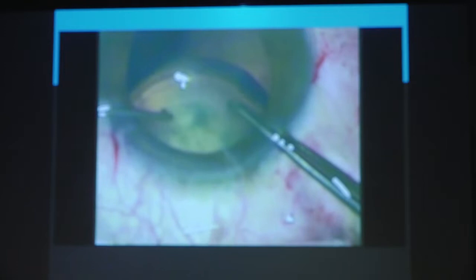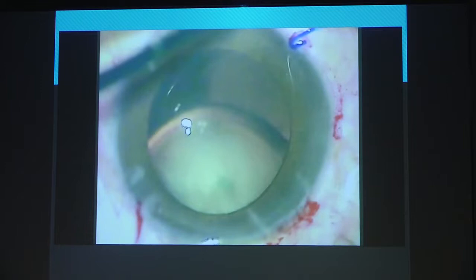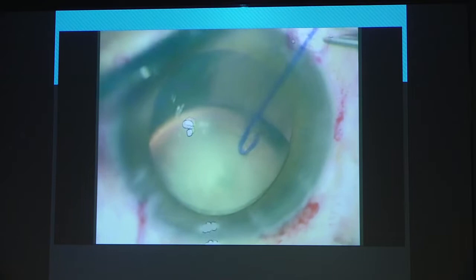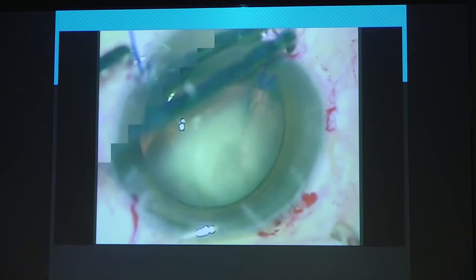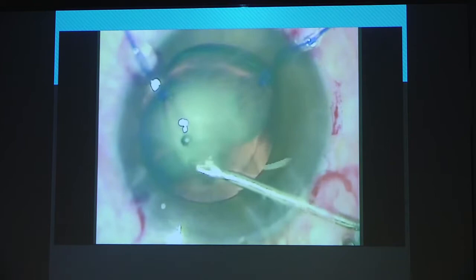So you do your little rhexis. You don't have to do a very big rhexis because these cataracts are always very soft — a small little rhexis is enough, but just make sure you do it. Then you use your hooks. There is an option of using regular hooks or capsular hooks. I don't like capsular hooks because they are far too long — I like using the regular hooks. Thread it through, use your regular hook, and suspend your lens up. Once your lens is suspended up, then we can breathe comfortably. Nothing much is going to happen.